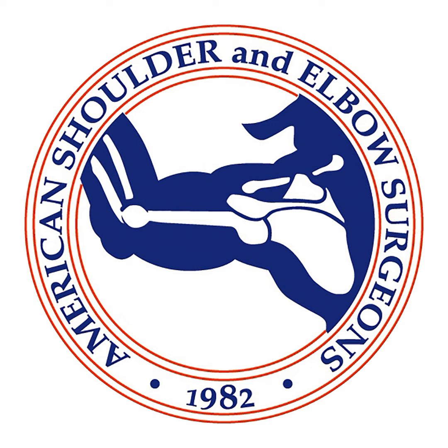So okay, got it. Your combination here is you've got tapes through the muscle, out through the cannula, through the patch, and then in addition you've got a suture that goes from the Neviaser out the lateral cannula through the patch, and then you pull that suture in addition, so it gives you kind of a push-pull at the same time? Correct.